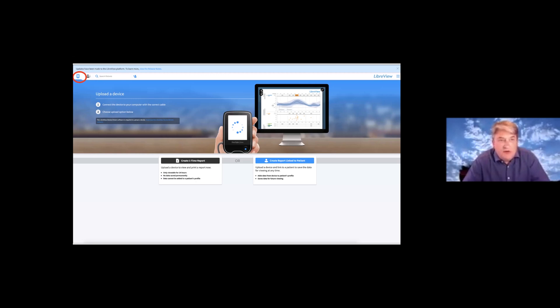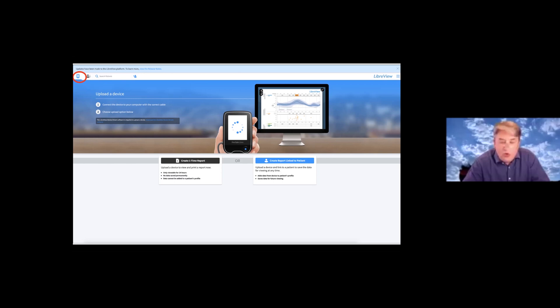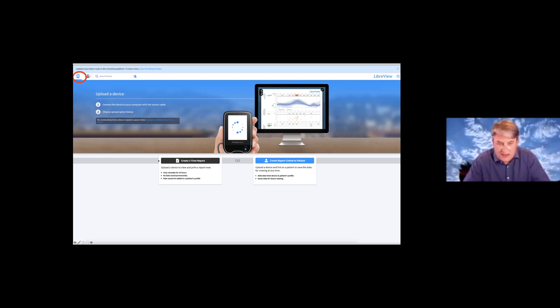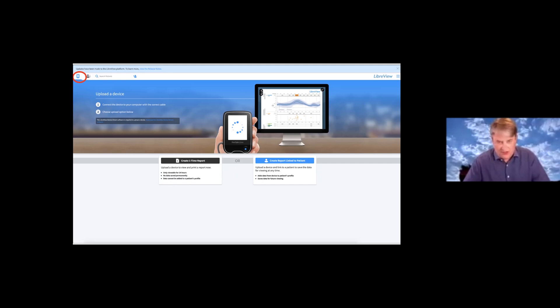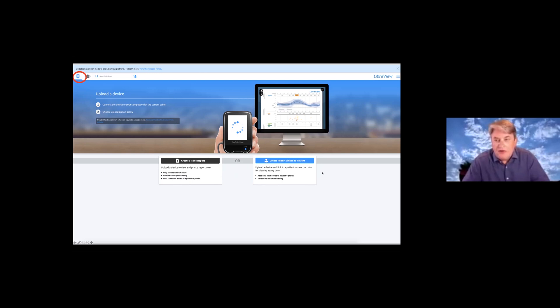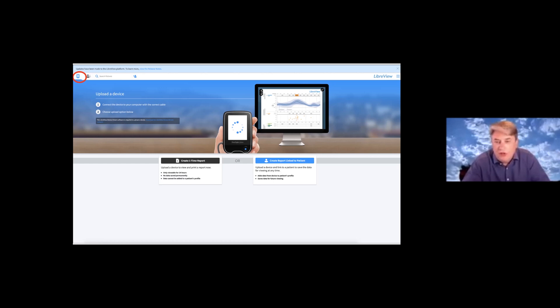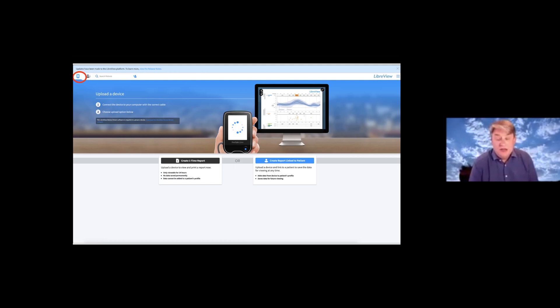It always starts in the screen intended for data upload. There are two ways data can be uploaded: one to create an anonymous report from upload — which if you're in a healthcare professional environment is a potentially reasonable way to upload data — and the other is to create a report that links into an account that's already available. There are some challenges in a healthcare provision environment using the linked patient upload option because we're pushing data through a firewall, which then becomes potentially insecure. If it has patient identifiable information on it we do need to be careful, and everybody's healthcare environment will have their own views on whether that's an ideal approach.